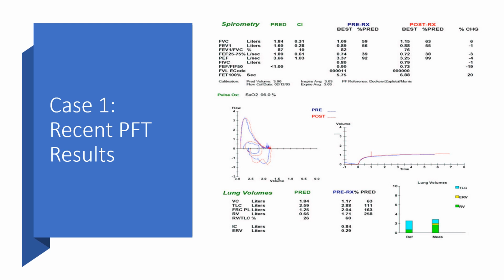So in the upper right, we basically have this patient who's done spirometry. They have the best forced vital capacity of 1.09, and that's the top line of that upper right there. This individual is able to do 59% predicted. And then the patient gets a breathing treatment.